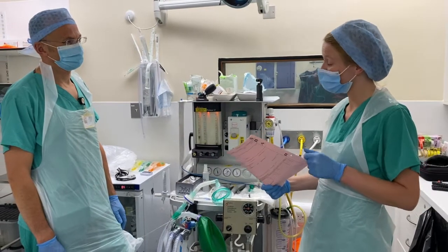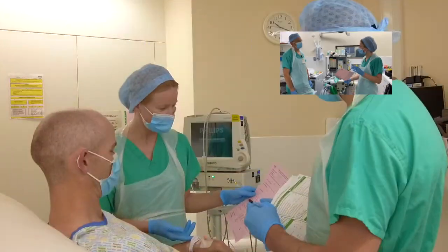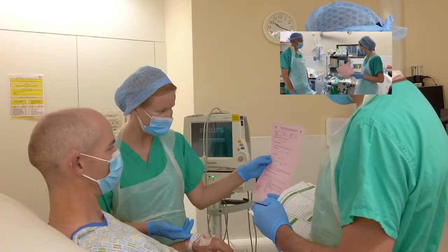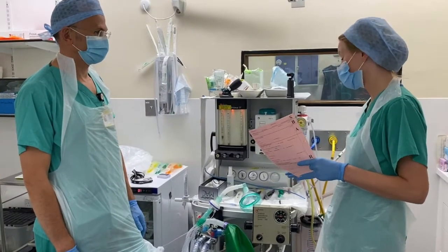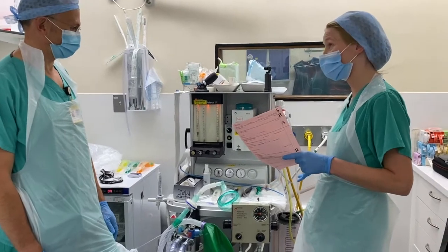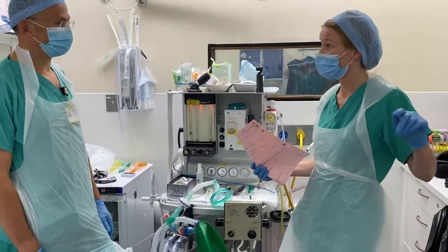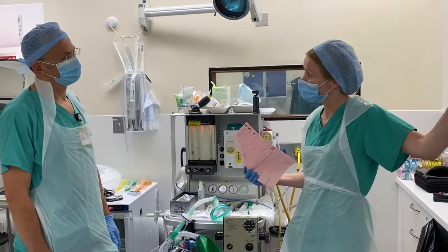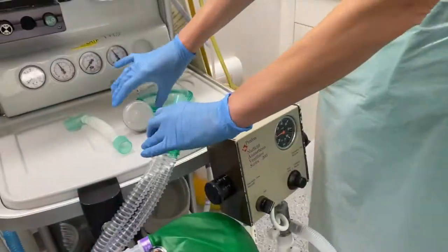Patient and clinician preparation. Ensure that the anaesthetic assistant is prepared and perform a WHO sign-in. Check that your supervisor is available. Discuss the airway plan with both your assistant and supervisor and confirm roles in an unanticipated difficulty, including who should call for help if required.